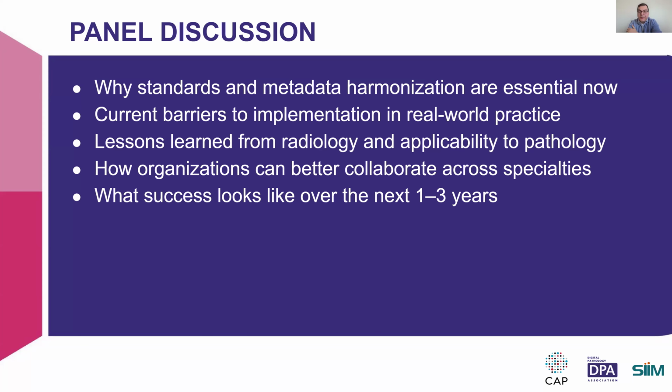Right. So the first barrier, even with our institution, was the file size, which is storage. That's a common reality. A single whole slide image, as we all know, can sometimes reach more than 4 gigabytes. With that kind of architecture, radiology is used to much smaller sizes than this, and the majority of PACS and archiving systems and VNAs are not really designed for this.